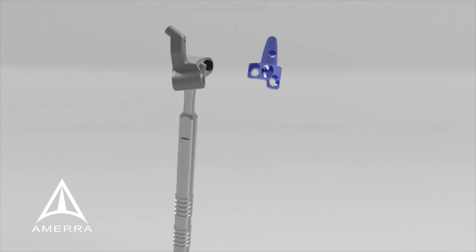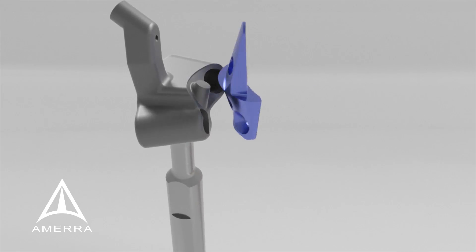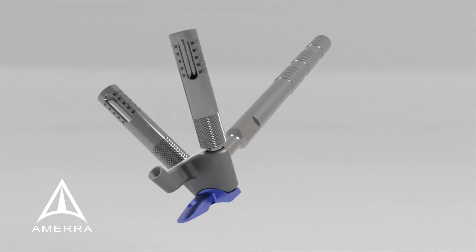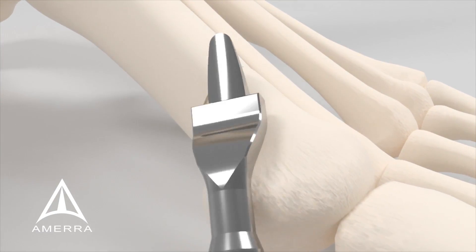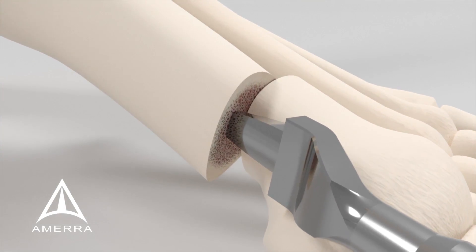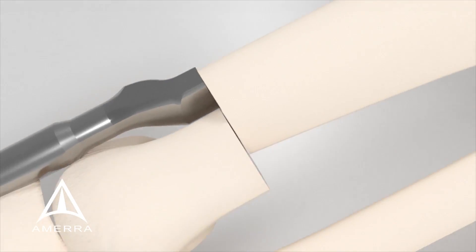Assemble the plate construct by securing the desired MIB plate to the appropriate plate placement guide using the threaded drill guides. Manually or with the use of a small mallet, broach at the apex of the deformity in the proximal medullary canal while distracting the distal bone segment.